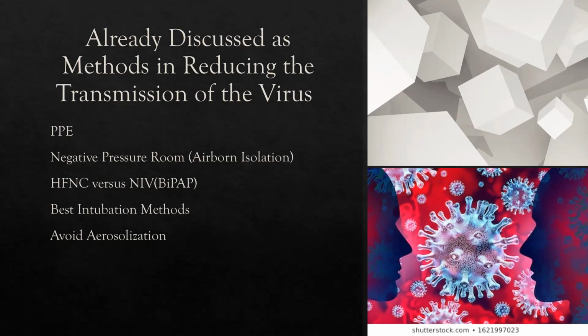So the high flow cannula develops a little bit of positive pressure with it. And then of course, increased amounts of oxygen, you're heating and humidifying the air, and then they breathe it in. So it helps with hypoxemia, it helps a lot. Or you can put the patient in non-invasive ventilation and BiPAP, where you set an IPAP and an EPAP and help their work of breathing during inspiration. Oh yeah, and then add your expiratory filter on the exhalation port.